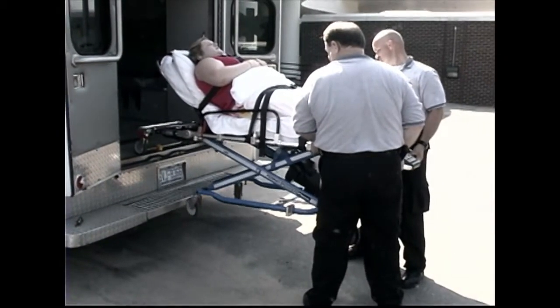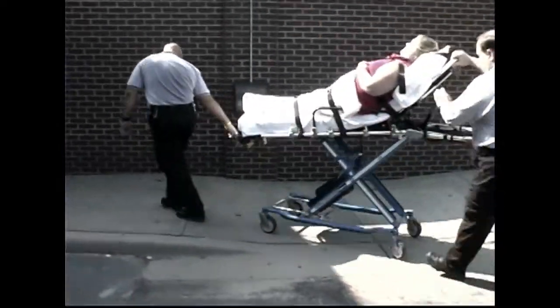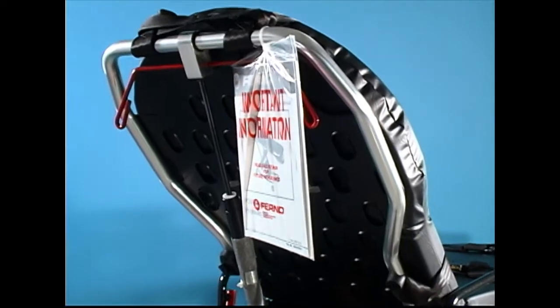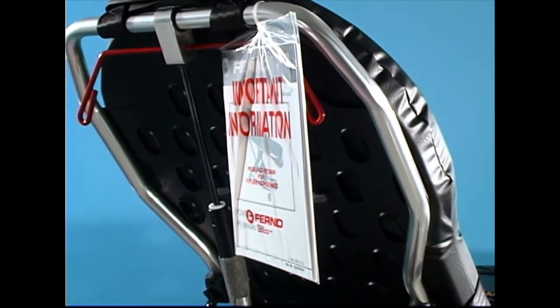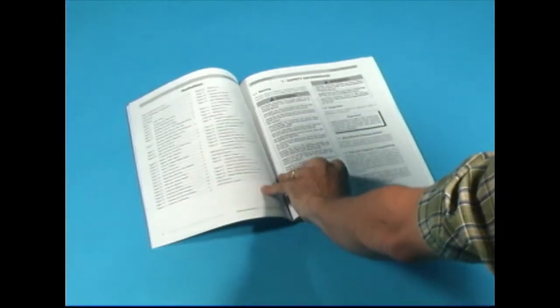Getting started is easy. This video provides a quick start guide for your new PowerFlex powered cot. Please refer to the manual included with your new PowerFlex for detailed guidelines and usage instructions. Also, refer to the manual for guidelines on the proper care and maintenance of your PowerFlex.